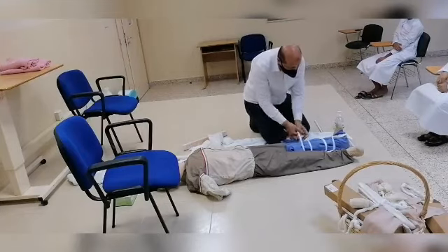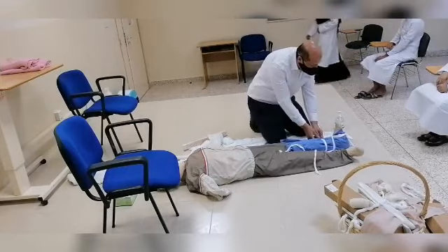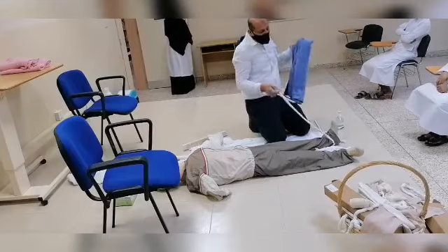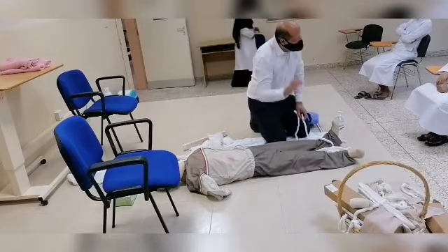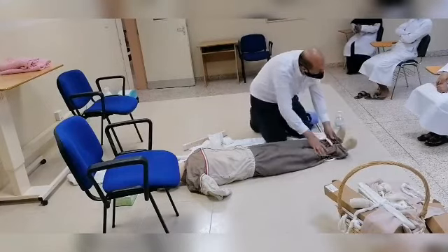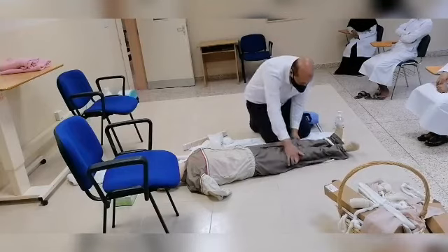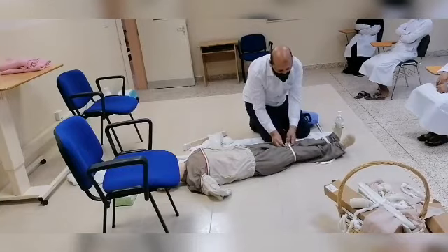The third type is the anatomical splint. In the anatomical splint, this leg has a fracture and the other one has no problem. So I will bind them together. By binding them together, it works in the same way.